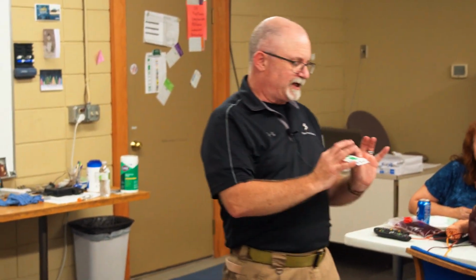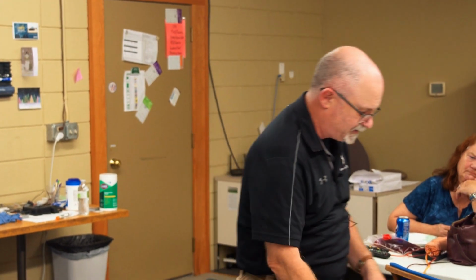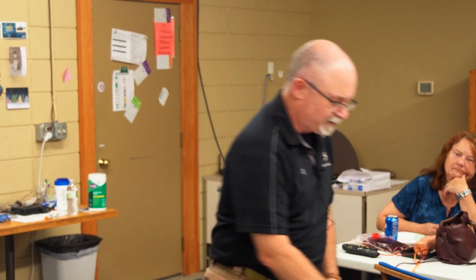So a couple pieces in here. This is your brand name Tegaderm, because you guys get nothing but the best. We use the Vanguard, and I like Tegaderm better. This is an occlusive dressing as well, but not meant for penetrating trauma. It basically just covers up your IV site. This is a handy little thing which we're never going to use. It's who started it and when and whatever.